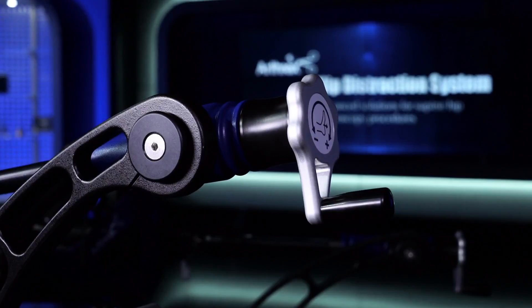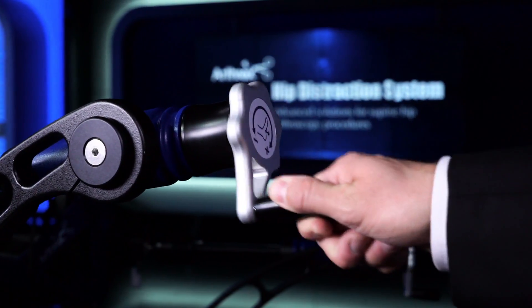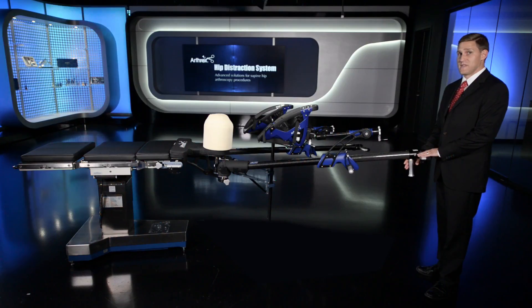Your fine traction is controlled and titrated by this fine traction knob at the base of the Teletrack carriage spar. The range of motion for your leg can be controlled via the levers and triggers at the end of the operative spar.